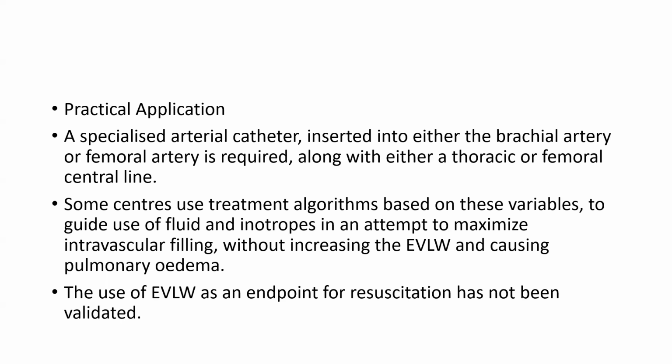Now about practical application, a specialized arterial catheter inserted into either the brachial artery or femoral artery is required, along with either a thoracic or femoral central line. Some centers use a treatment algorithm based on these variables to guide the use of fluid and inotrope in an attempt to maximize intravascular filling without increasing extravascular water and causing pulmonary edema. The use of extravascular lung water as an endpoint for resuscitation has not been validated.